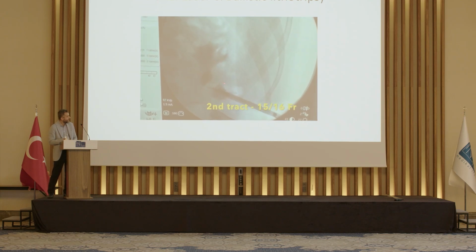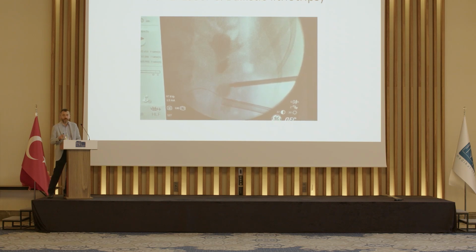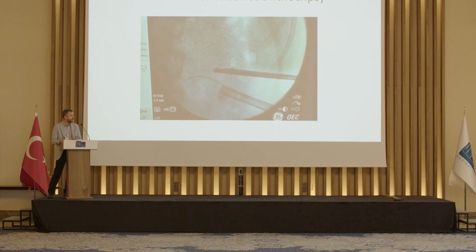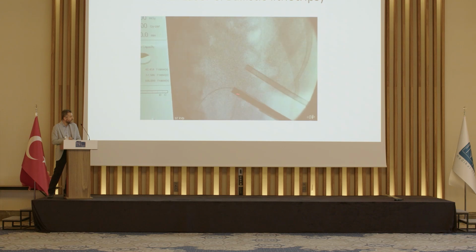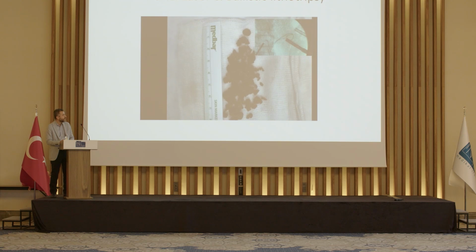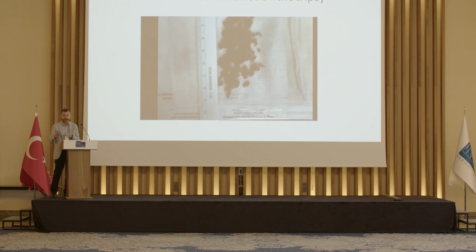I have stones in another calyx, so I need a second tract. Here I make a second puncture that is also mini 16 French, and just fragment the stone into the pelvis and take those big pieces out of my first access. And in this way, with the combination of the holmium laser with the ballistic, we are much more efficient. The total duration of the surgery was just less than 40 minutes, and the patient is stone-free, and we can discharge the patient the next morning.